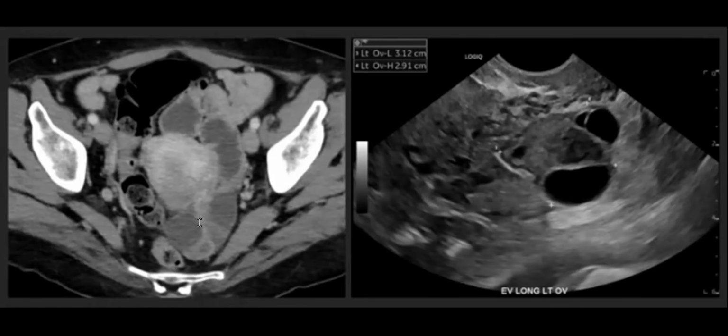I think that MR would be the next best option, I agree. Yeah, I think you definitely need an MR for diagnosis because you need that T2 signal. And if we bring it up, they can actually do fertility sparing partial oophorectomy and get it frozen. If it's cystadenofibroma, then they can actually do fertility sparing. So it is important to bring it up.